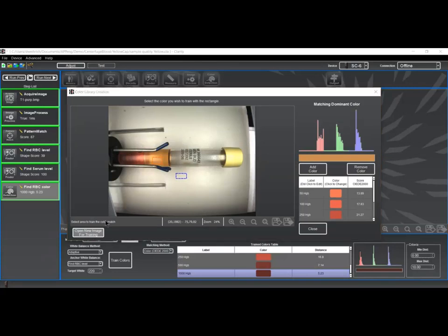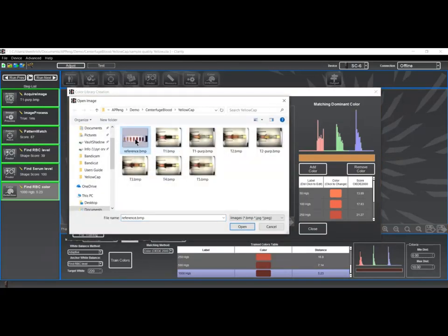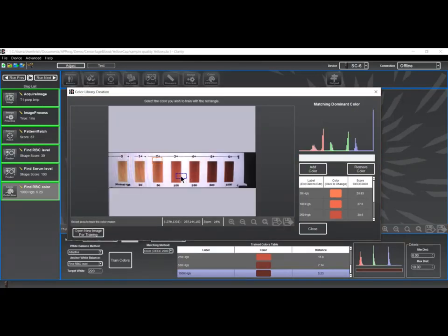What's also oftentimes done is to collect a picture of a reference strip from either a bottle or a document of some kind and capture the colors off of that. Now this is a picture that was captured off of physical paper in the same fixture with the same lighting as my sample examination is done, just for consistency of lighting and color calibration.